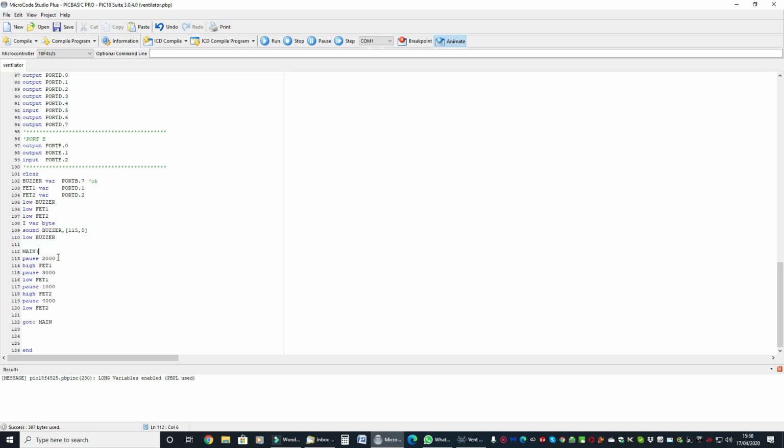We're going to ask the microcontroller to pause for 2 seconds, because this is obviously in milliseconds here. We're going to turn the output high for FET1, so that's going to be on for 3 seconds, and then we're going to switch it off, and it's going to be off for 1 second. And then the exhalation side, which is FET2, we're going to make that solenoid high or on. We're going to pause for 4 seconds, so the program will switch that on for 4 seconds, and then we're going to go low for 2 seconds. So we keep some PEEP in there, and then basically it loops back to the beginning of the program. So when it loops back here, pause for another 2 seconds. So let's see if this works.